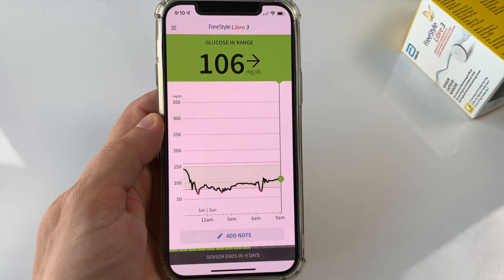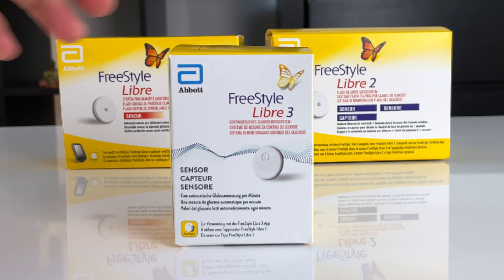I'm going to show you how to start your first Freestyle Libre 3 sensor and how to get going with the system in less than five minutes. Because if you got yourself this brand new good-looking bad boy, you probably can't wait to start using it.